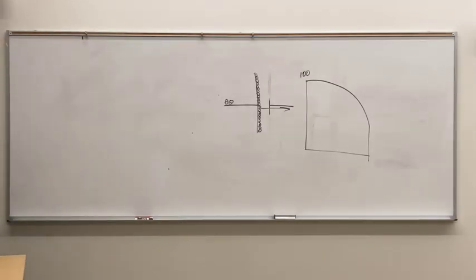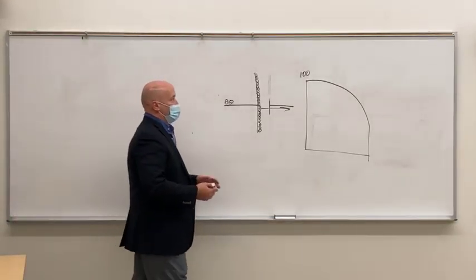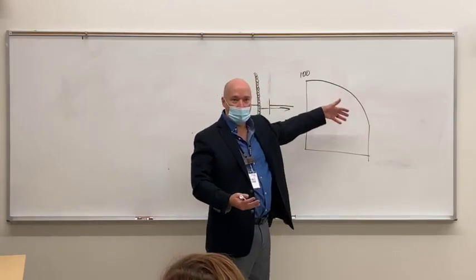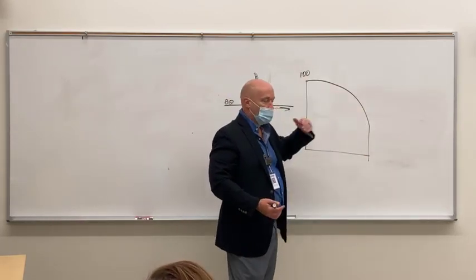That is not to be confused with a falling load generator, which is next in the textbook. Falling load generators kind of work, on an illustration, in the same way, but your kVp doesn't drop on a falling load generator.